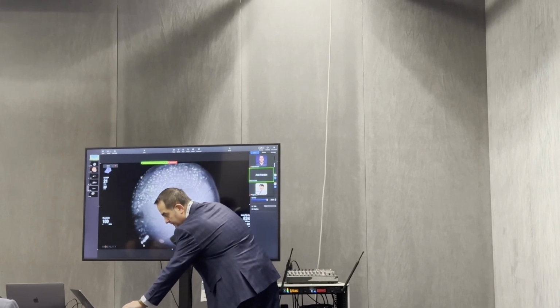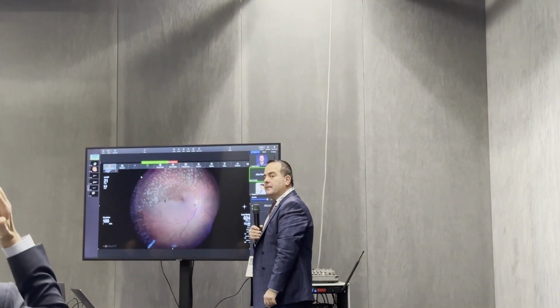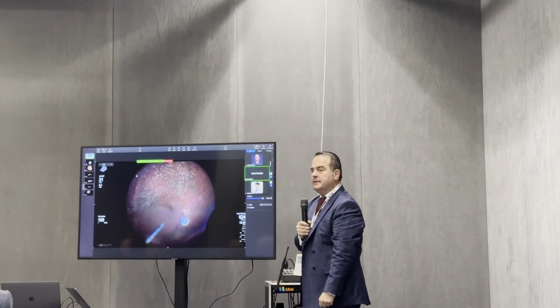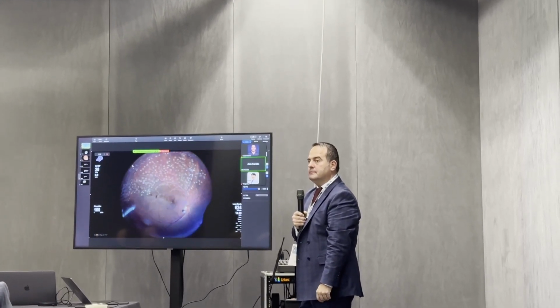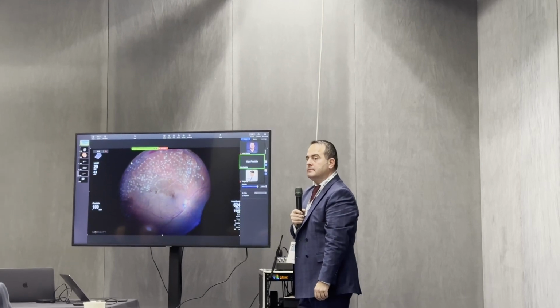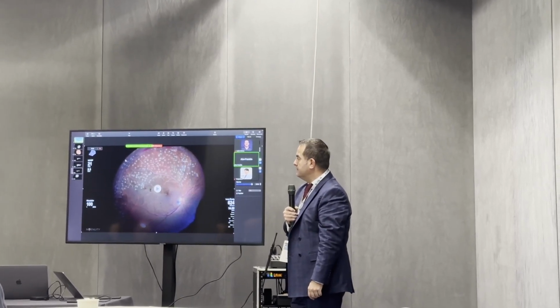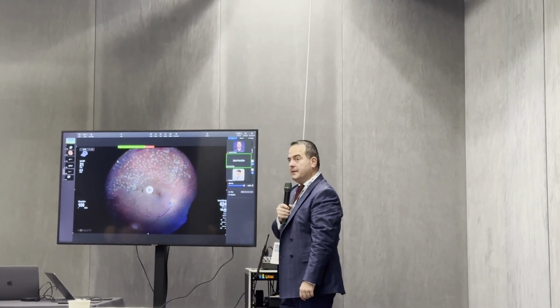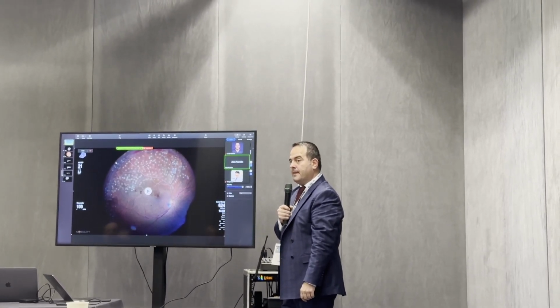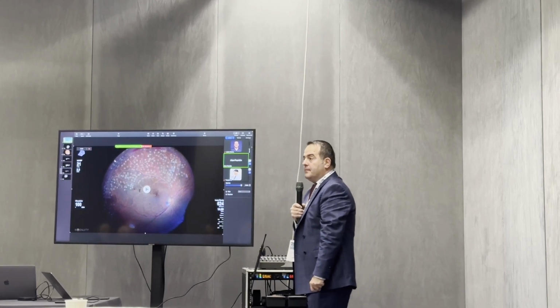So Lukan, these images are fantastic, and I love the way you switch back and forth, because there's biomarkers in the color photograph that we don't understand until we look at the angiogram. Right? Because you can see, now that we've seen it on the angiogram, you can see the non-perfusion on the color photograph too, right? Yeah. Right? But you wouldn't know that unless you looked at the angiogram. So this is so powerful. And you still think it's a thing?